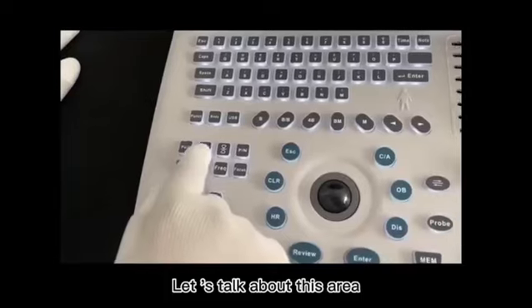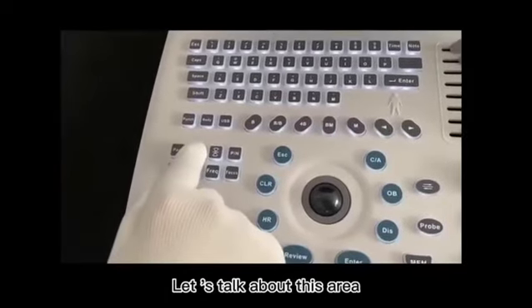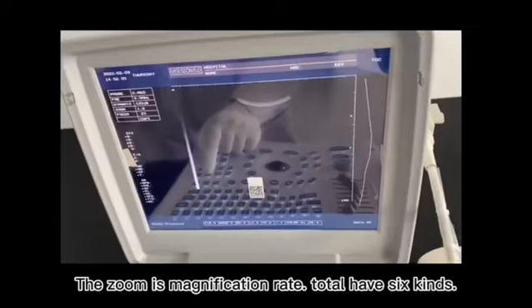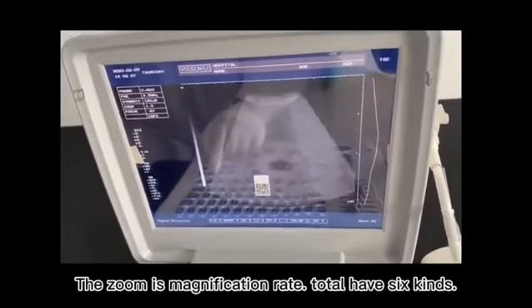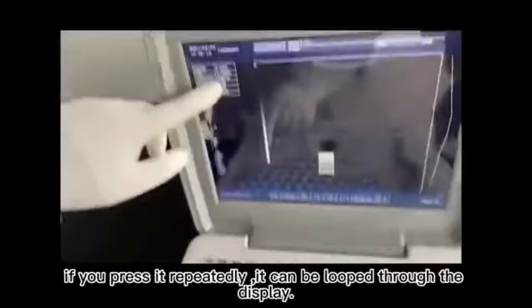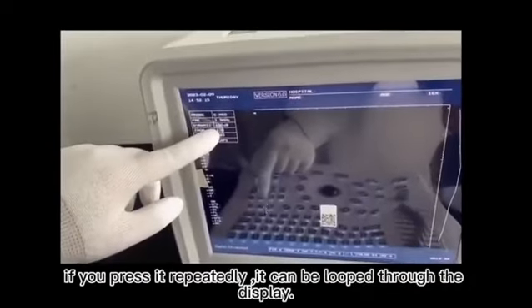Let us talk about this area. The zoom is magnification rate. Total have 6 kinds. If you press it repeatedly, it can be looped through the display.